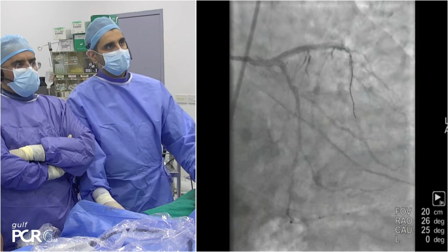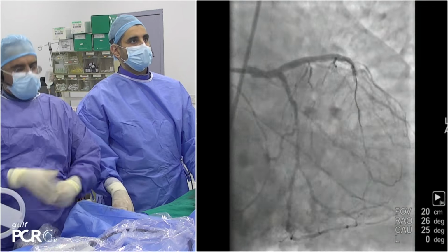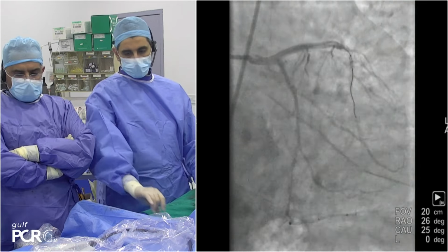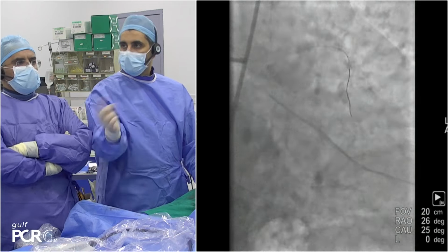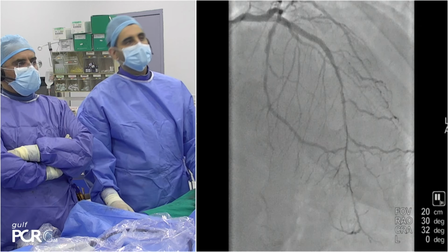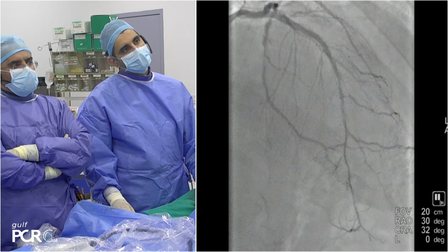I would assume his stress test would still be positive, but there is not much to do in terms of stenting. Maybe we can ask for a very short answer. Arif, would you do anything more to the distal LAD? It doesn't look angiographically nice. It's a hot question. Would you stent it or not? I would do a 2.5 gentle deployment, 8 or 12 maximum. Only that. We were just discussing that offline.